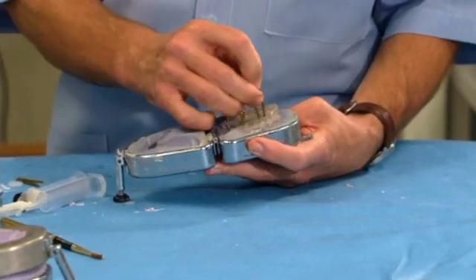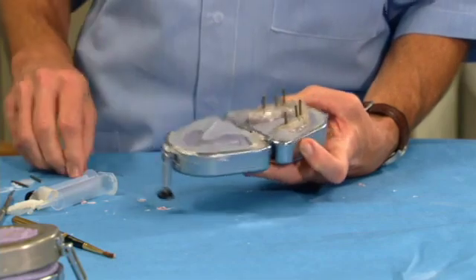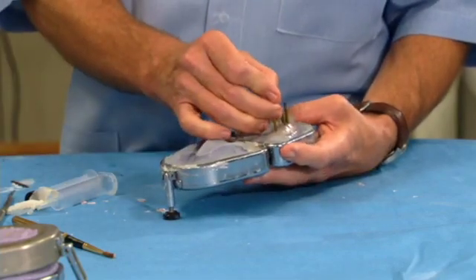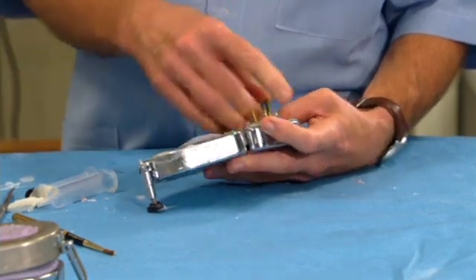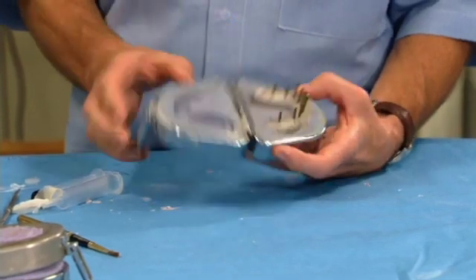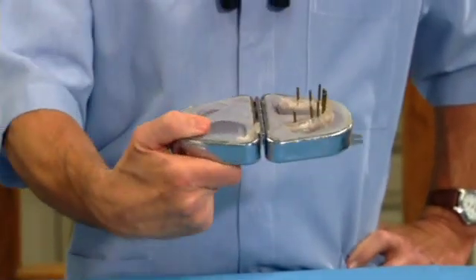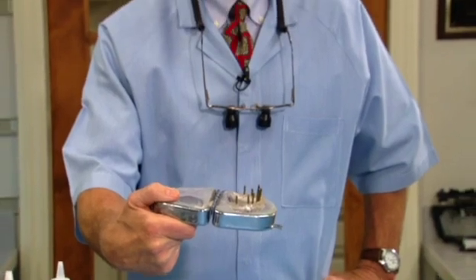I'm now using some bone sounding techniques, and these tell me where I need to go to place my implants. I know the thickness of the tissue by doing bone sounding, just like I learned from Frank Spears. When your patient has teeth, I now know the inclination of the implants. Can I get them straight? Am I going to have to use an implant that's off-center?